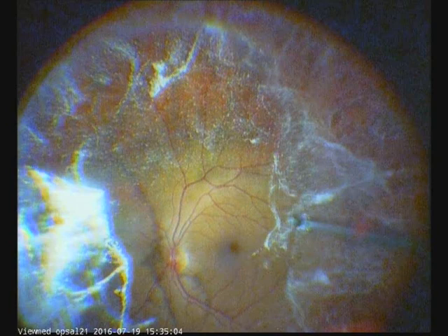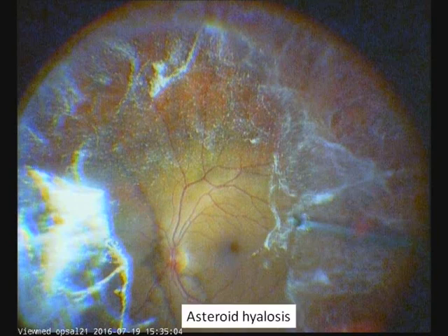Well, this is interesting. Fundus finding during vitrectomy. What is your diagnosis? This is an asteroid hyalosis. Asteroid hyalosis, which disturbs the patient.